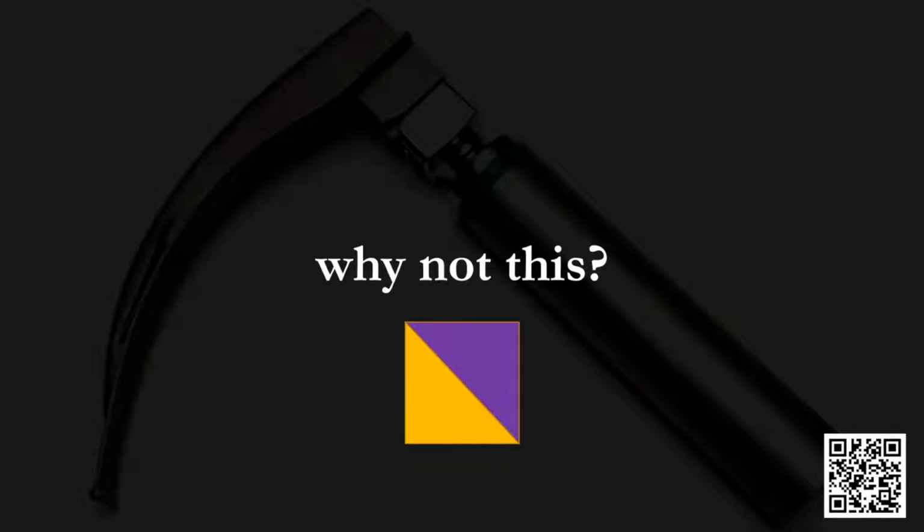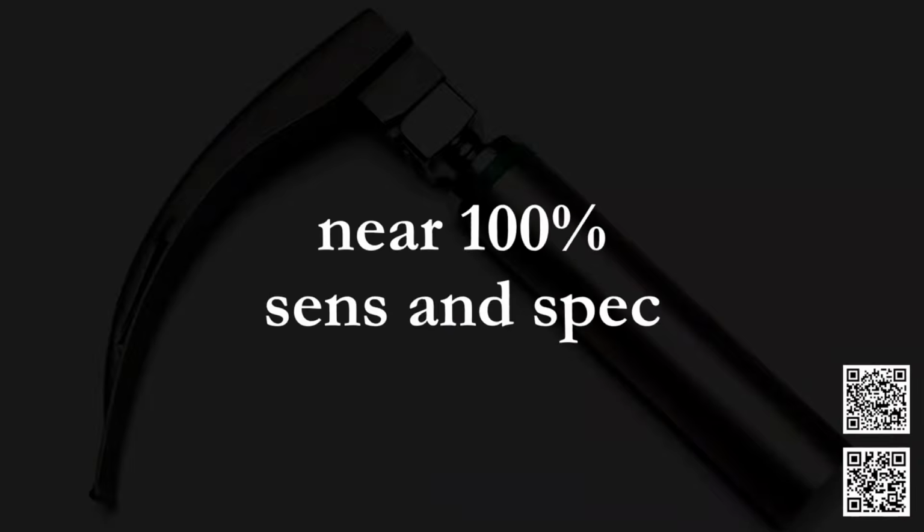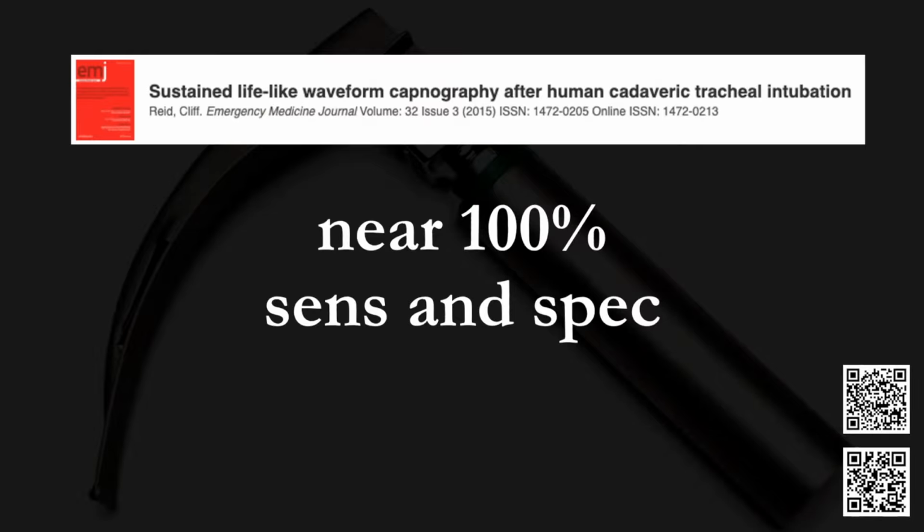When you use waveform capnography, the sensitivity and specificity for correct placement within the trachea is near 100%. Can't get better than this. If you don't have this waveform, then you really need to think twice, because it has been reported to obtain waveform capnography off of cadavers. So if you don't have a waveform, the first thing you should think is, I'm not in the right spot. And then after that, you can start to think about equipment failures and things like that.